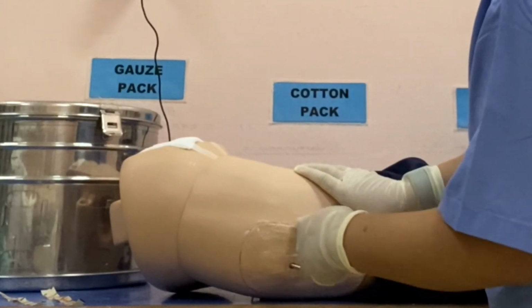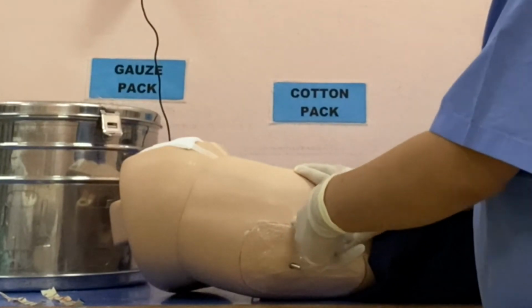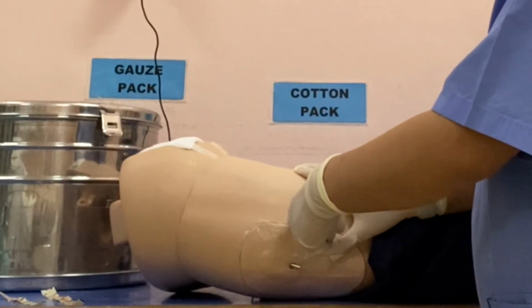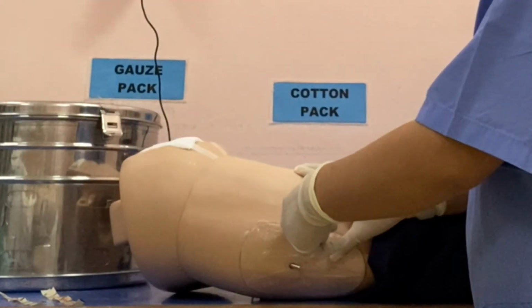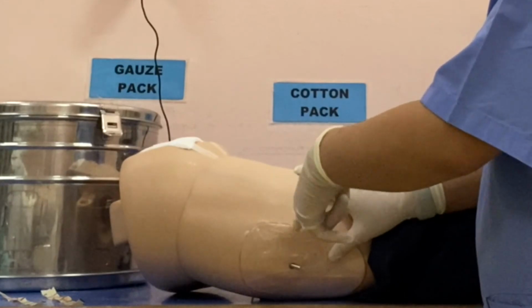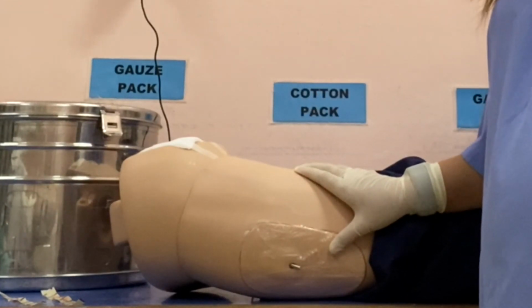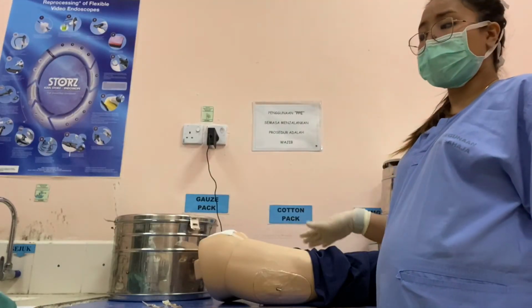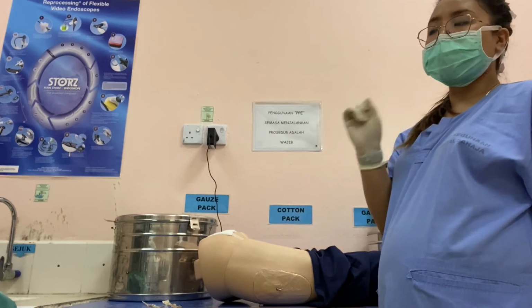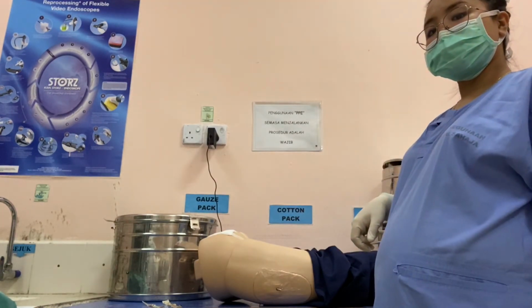You can just poke 90-degree injection, withdraw a little bit. If there's no blood, you can inject the medication and wait for 1 to 2 seconds, and then you can take the syringe out and throw it in a sharp bin. The poke site is almost the same as the vastus lateralis.